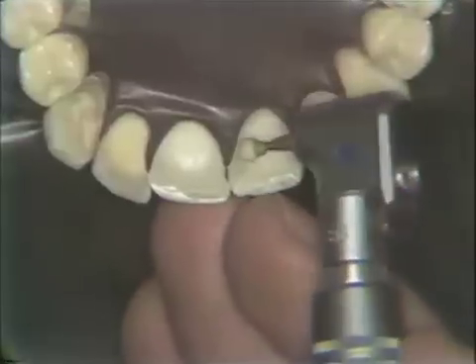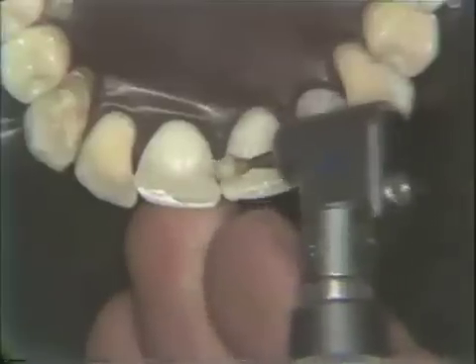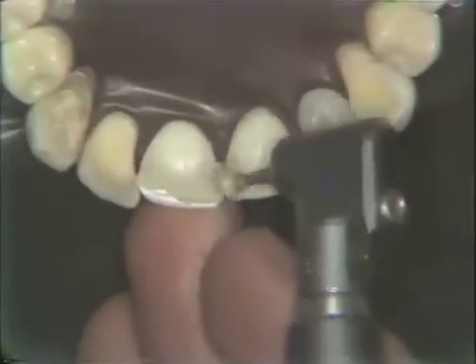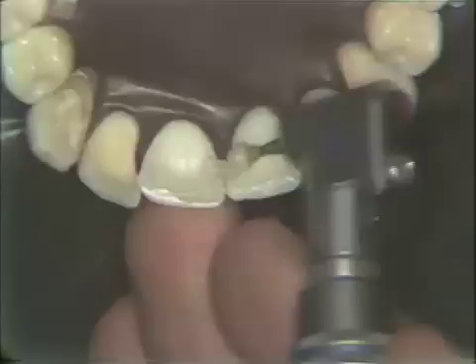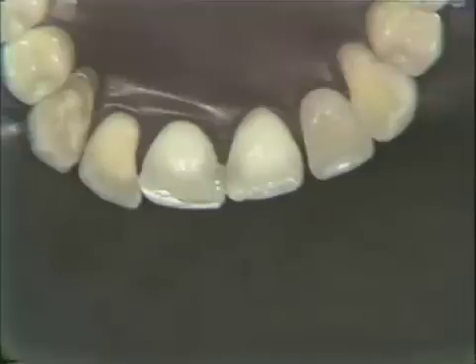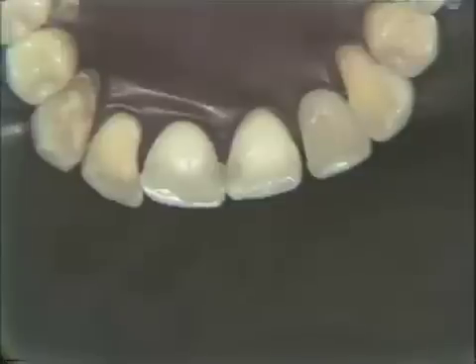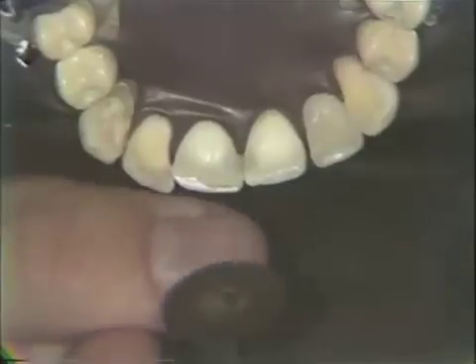And we can come back. We noticed that there were a few little grooves placed on that lingual surface, so we will come back with a white Arkansas point, the very fine one, with a lubricant, and just gently touch again. Patients' tongues are very susceptible to any change, and they'll often say to you, "Doc, that feels rough." So this, after we get the rubber dam off, is a final check, really, what we can do.